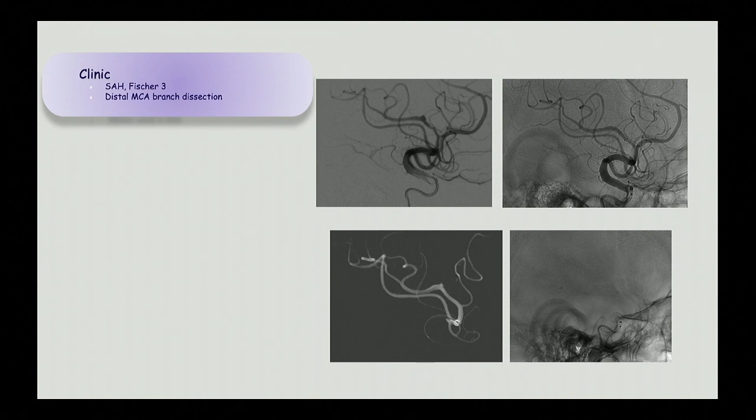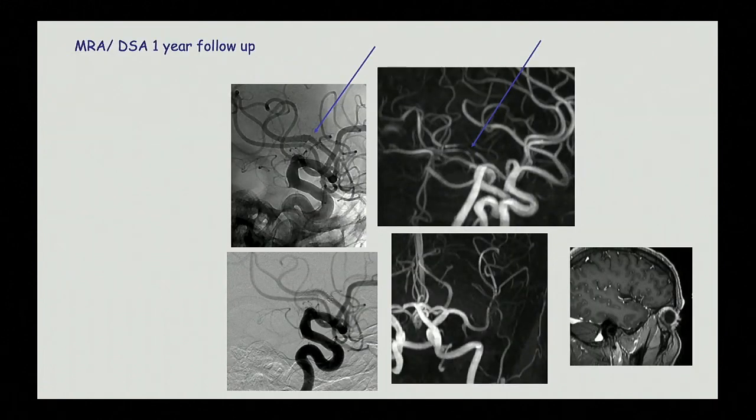You see before treatment, you see the result. It was angio before treatment, you see the aneurysm. And we had implantation of a flow diverter. You can see here, distal. And this is a result at 1 year.